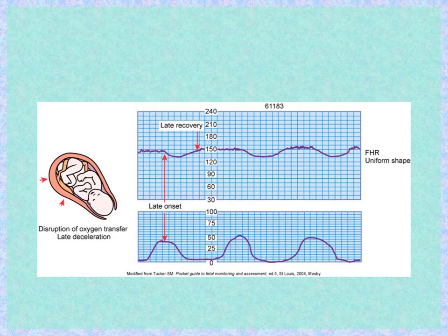Generally, late decelerations are associated with uteroplacental insufficiency, but they can be seen with maternal hypotension, uterine tachysystole, preeclampsia, postdate or postterm pregnancy, amnionitis, small for gestational age fetuses, maternal diabetes, placental previa, placental abruption, conduction anesthetics, maternal cardiac disease, and maternal anemia. They should be considered an ominous sign, especially when associated with absent or minimal variability. Uterine tachysystole as a result of Pitocin administration can also cause late decelerations.